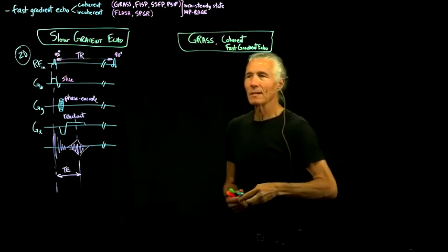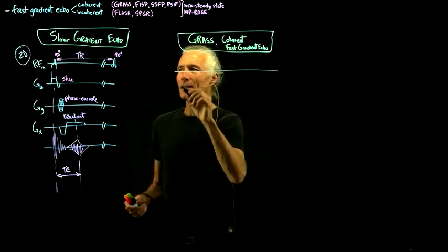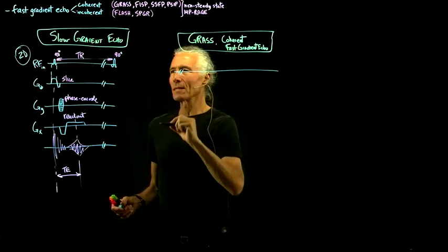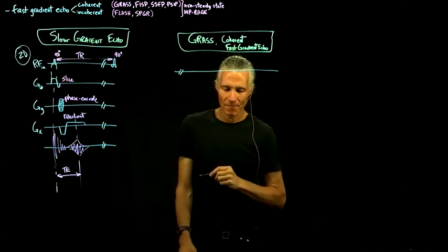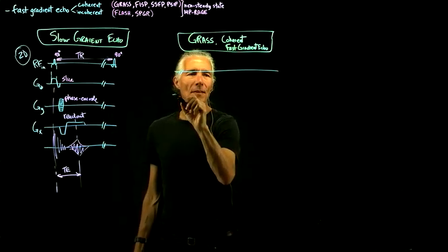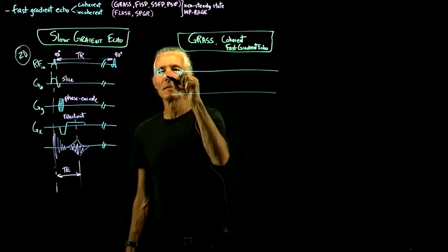Just like we did when we were deriving the equations, let's assume that we're in a steady state, so that we've been doing this for a while. So here's our RF in.